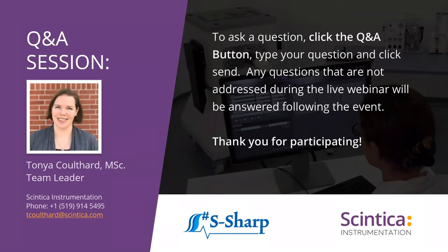Great. Okay. What's the maximum frame rate in B mode? Yep, so this often will come up with cardiac researchers, and I was surprised it wasn't one of the first questions that I scrolled through. The frame rate with a single element transducer is 30 frames per second for normal B mode imaging. The system does have a specific cardiac reconstruction mode, which is possible, and that's basically where the system is going to take as many 2-dimensional B mode images as it can, acquired with that ECG signal, and it can then reconstruct those images back into a cine loop of the entire cardiac cycle, and that would be at 190 frames per second. So that's going to give you a very nice frame rate for looking at cardiac function.